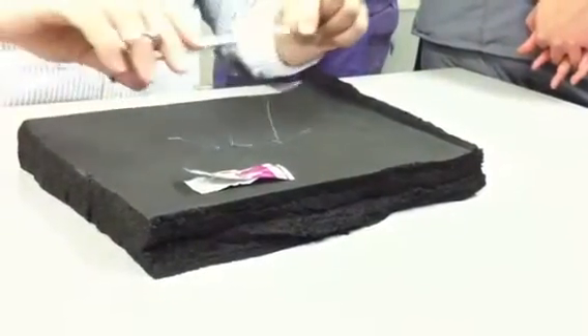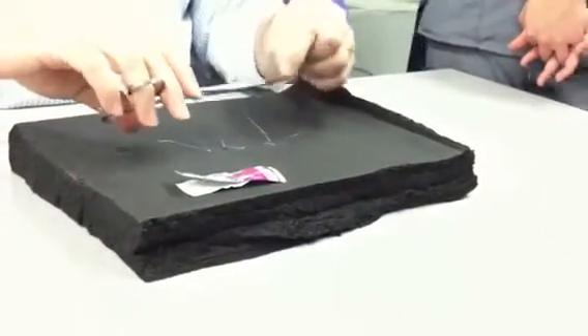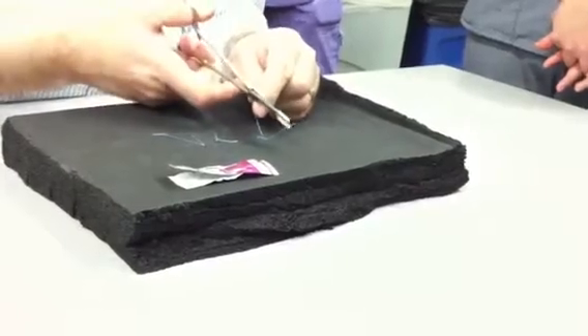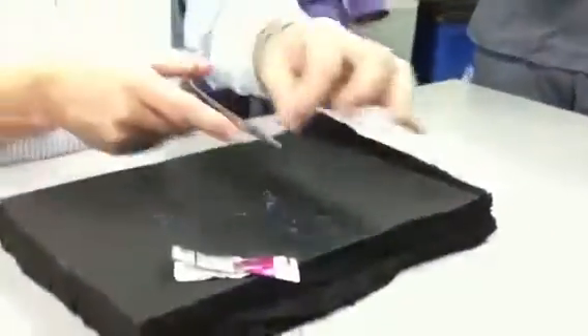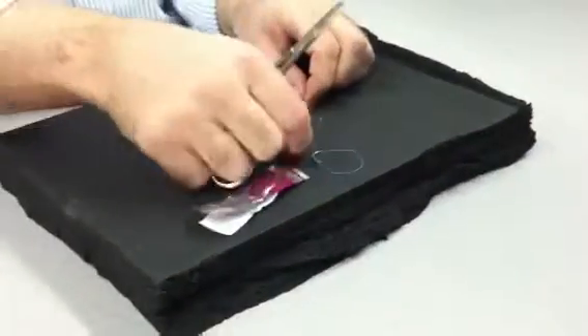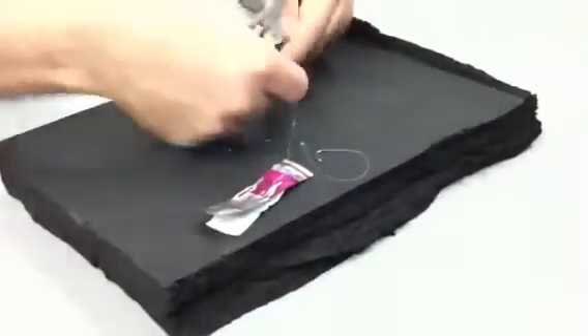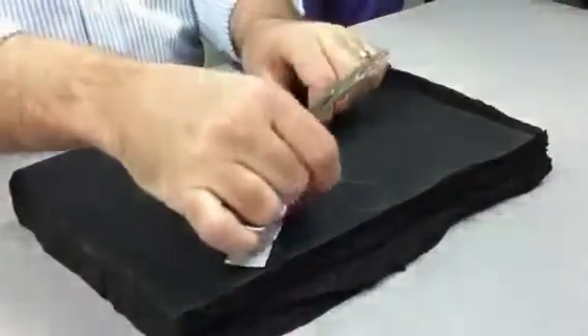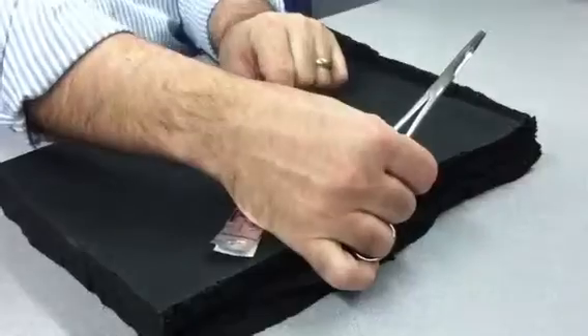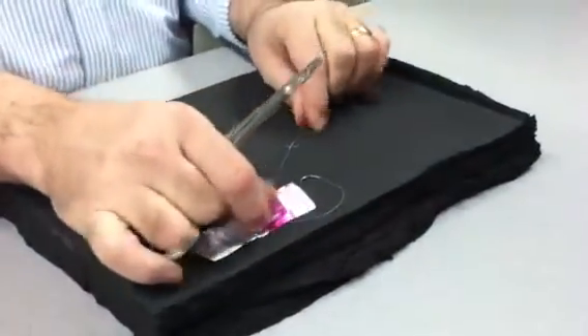Now we tie. There's a little bit of difference in this knot. We're going to do exactly the same two throws, grab the tip of the suture, but instead of pulling this way, I want to lay this down the way the knot's wanting to lay down. The knot wants to lay this way, so I'm pulling on a little bit of an angle. If I'm doing this, I'm twisting the knot too much. Let's lay it the way it wants to lie.